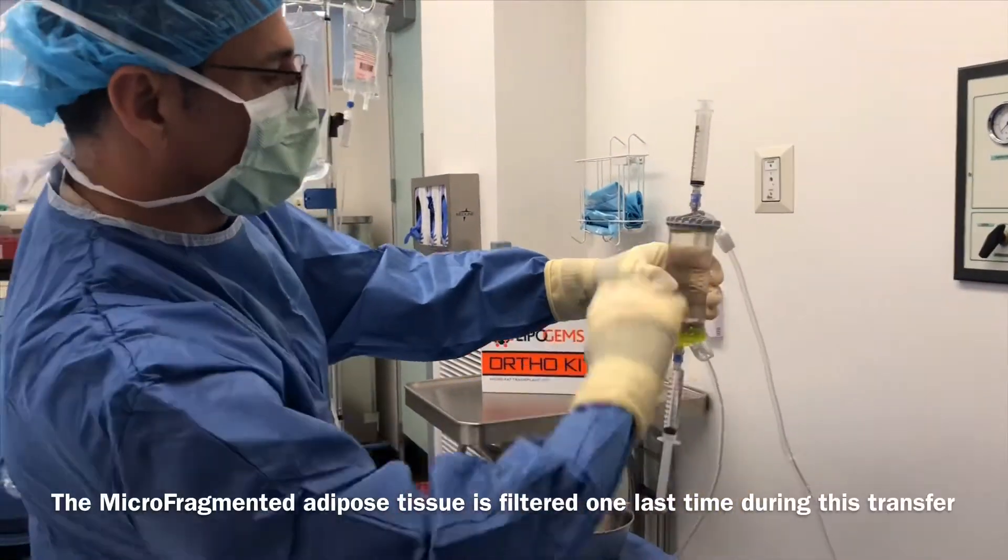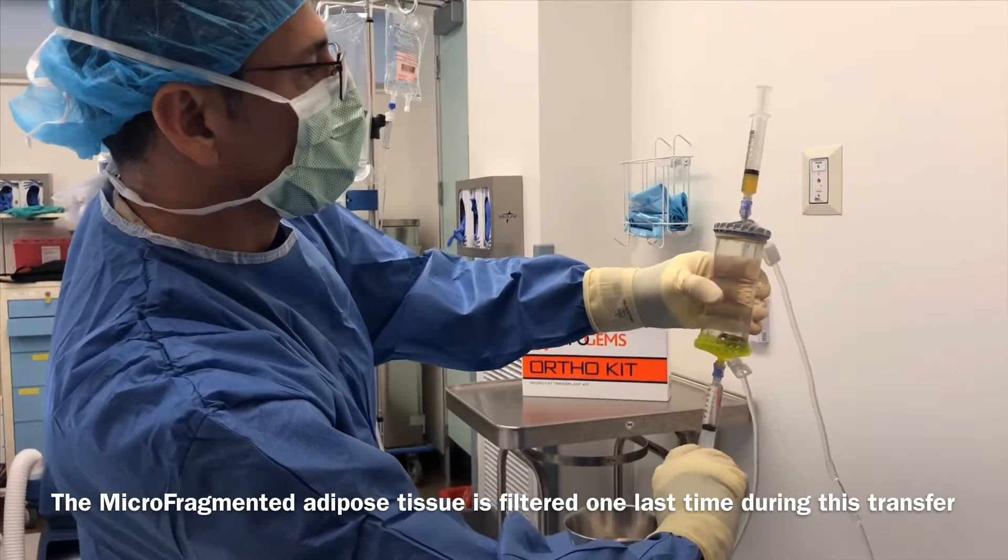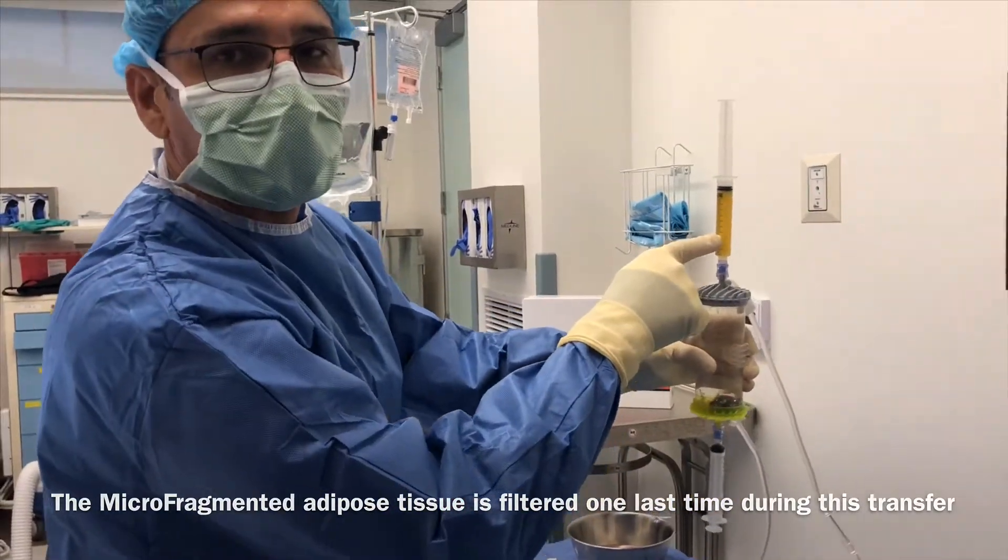We're going to be transferring the processed fat from here. That's what we will be injecting into the joints.